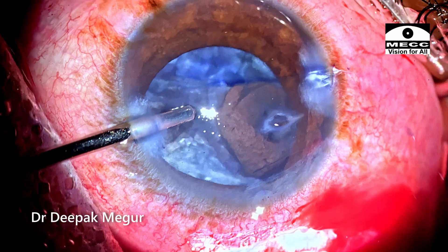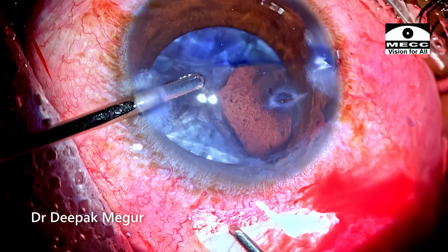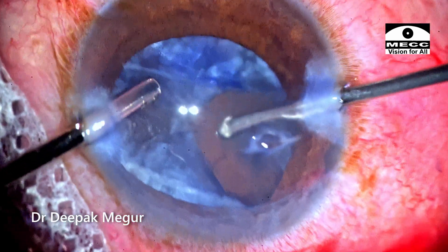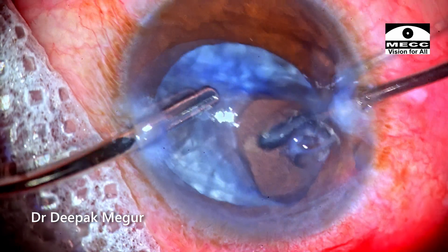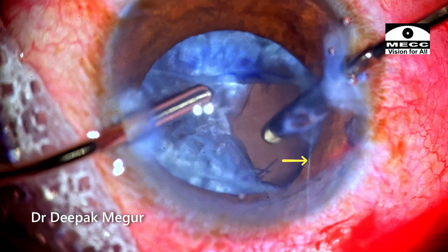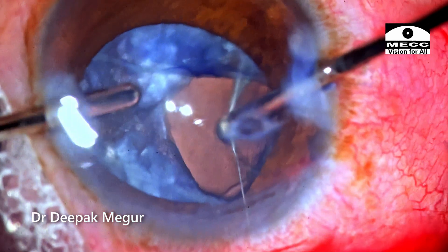Time to do the vitrectomy. Using a 23G cutter, the prolapsed vitreous in the wounds is first taken care of before introducing the vitrector through the side port, and then the anterior vitrectomy is begun. The visibility is very bad, so I'm just putting some viscoelastic over the cornea — it helps to see things better. I'm seeing this thick strand which is prolapsing towards the main wound and it is taken care of.